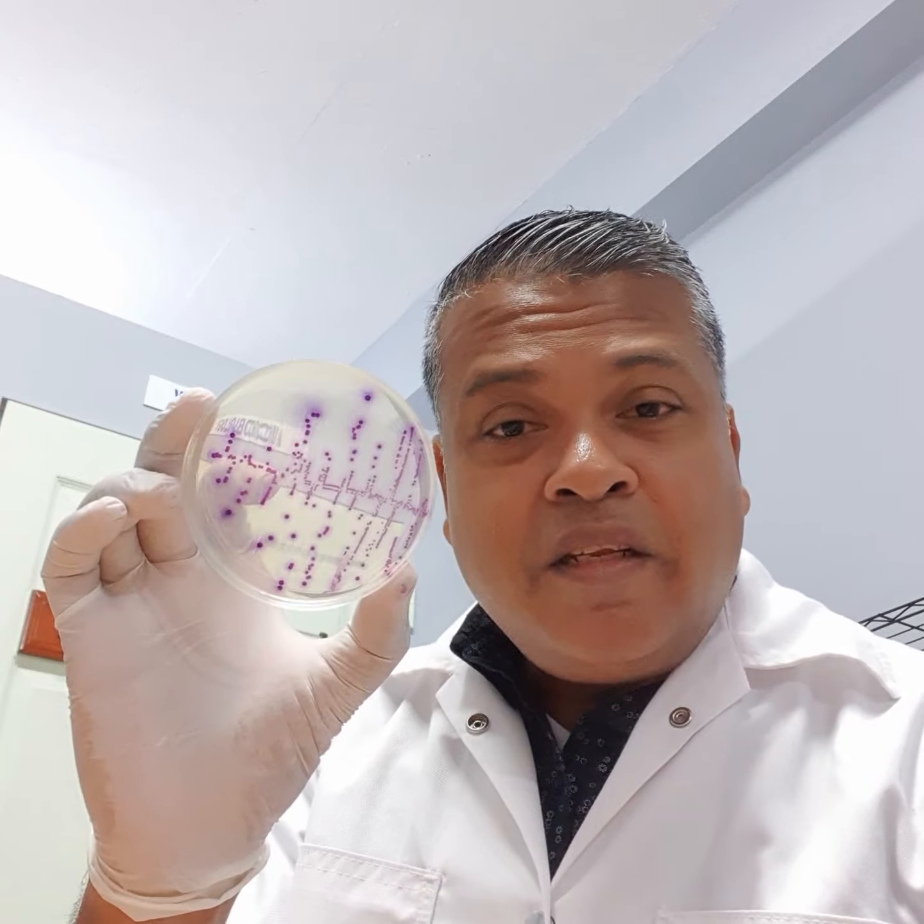Now, these different specimens, whether it's a seminal sample, a urine, a swab, they are inoculated onto these plates. And after they are inoculated, they are incubated in an incubator to provide the temperature that is optimal for the growth of the organism. After incubation, these plates are taken out and examined. I've got a lot of them in front of me right now. And these plates are examined for significant growth or for growth at all.